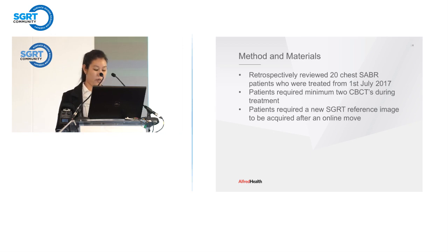All of our patients have their monitoring data recorded, so it's just a matter of going back and finding the ones that we needed. The monitoring data is recorded as a text file and gives us information such as positional deviation, when fields were gated, and when beam hold was activated, as well as much more.